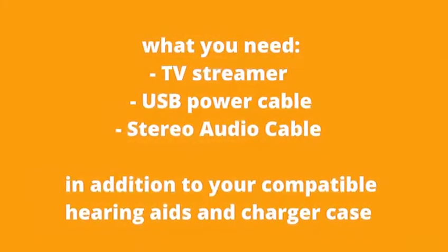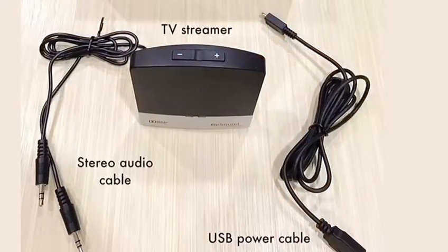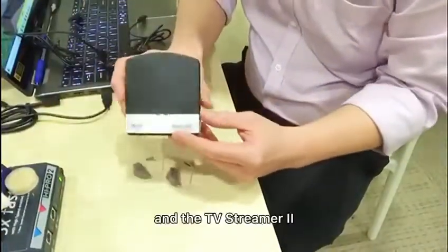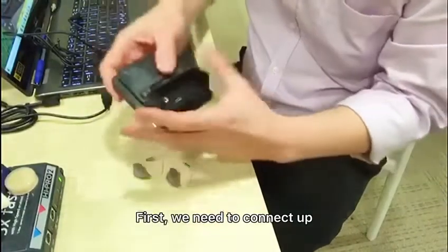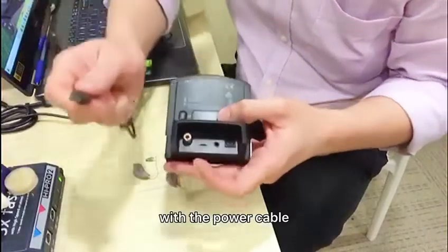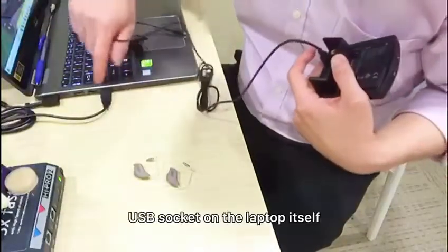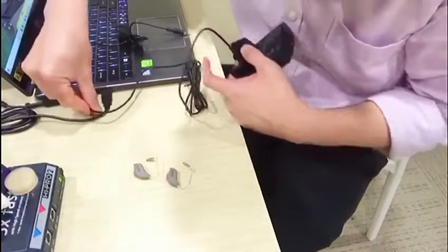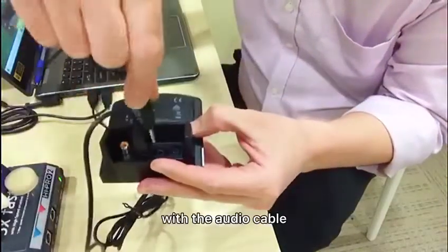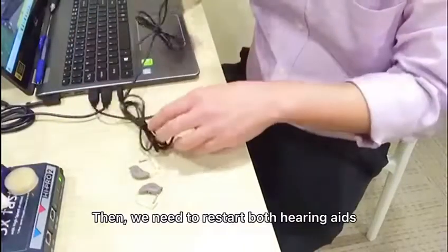Let me bring your attention closer to the setup. Here we have a pair of hearing aids and the TV Streamer 2. First, we need to connect the socket at the back panel of the TV Streamer 2 with the cable, then connect the other end to the USB socket on the laptop. Next, connect the audio socket with the cable and the other end to the laptop.